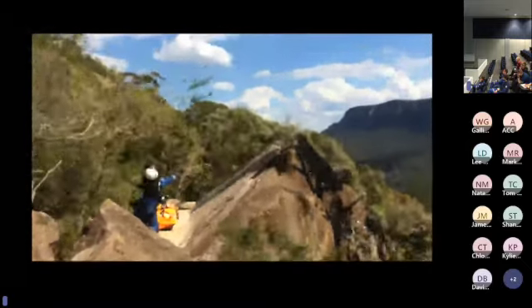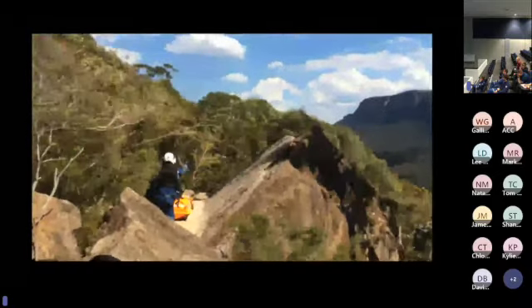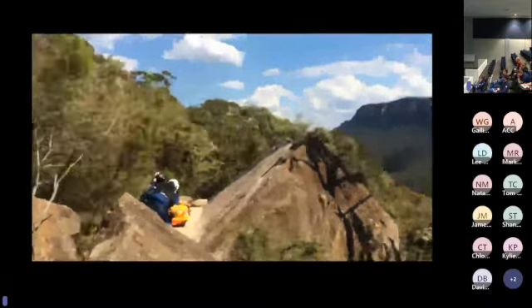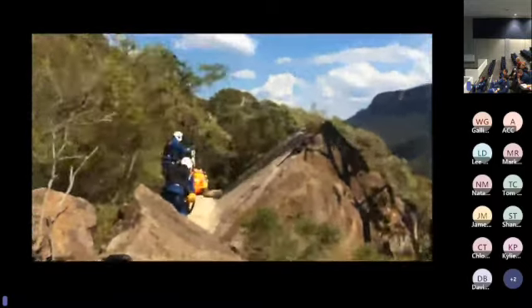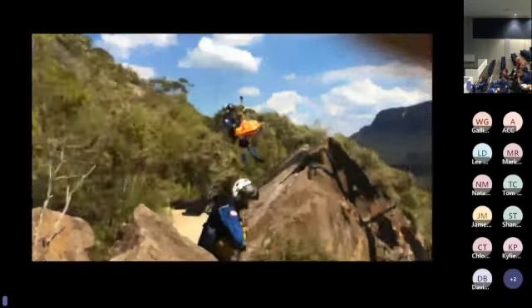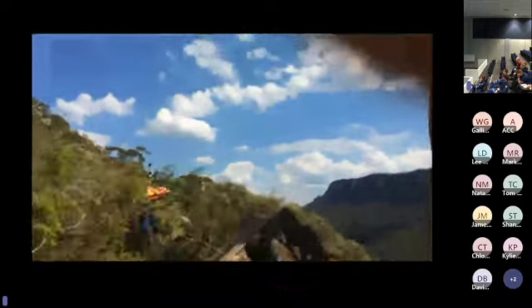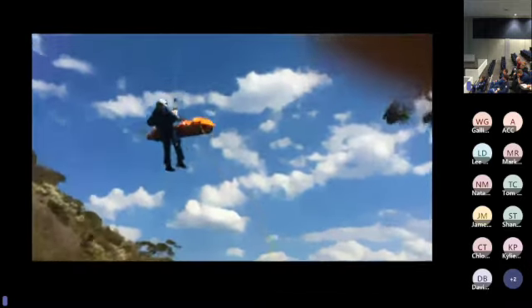It was blinded, and it was a few years ago now. I'll just let this play out. Essentially there, I'm doing the chops, I'm doing the hookup, and there are multiple periods where you're essentially going hands off the ventilator and you're stabilising the stretcher. And that's going to be part and parcel of that process. But we have a better way of doing it, and that's to use the ventilator.